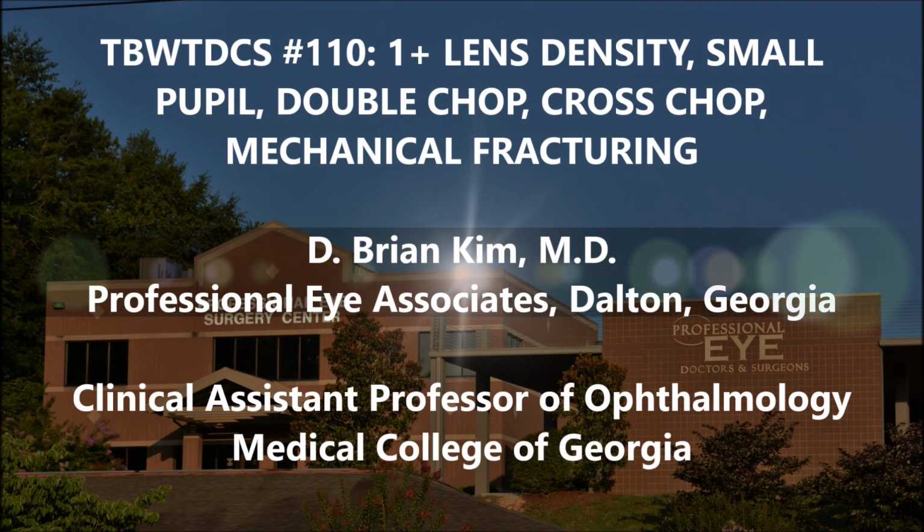I want to share with you case number 110 in the best way to do cataract surgery series. This is a 1 plus dense lens. It's really not a dense lens, but it's also a small pupil. And so you're going to see my standard technique, double chop, cross chop, mechanical fracturing techniques, how I'm able to hook lens pieces up out of the bag confidently, being able to crush the lens pieces without worry about being able to get the lenses out of the bag.